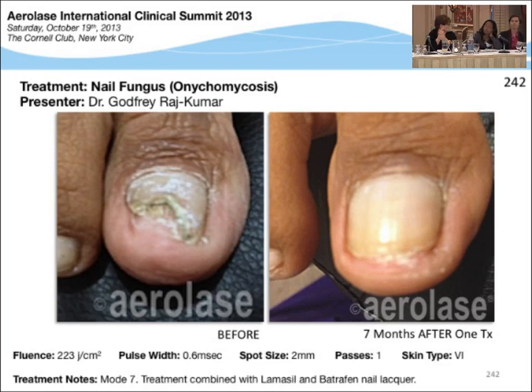Sounds good. Dr. Kirvis, do you use cooling? I just want to make a comment that you brought a very interesting suggestion about educating people that we are treating the fungus, we're not treating the appearance of the nail. That has to be brought up in the consultation and advise people about that. And then I think it'll come later on.